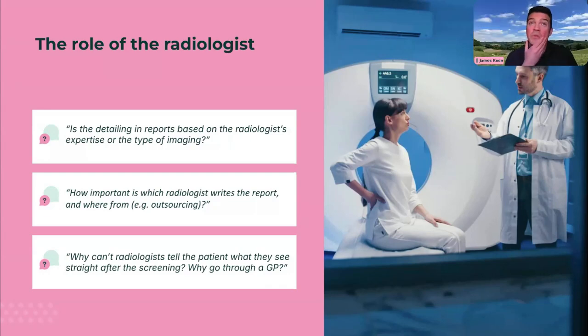The only caveat I suppose I'd put onto the end of that is that radiographers and radiologists, of course, do absolutely know what we're looking at on those images, and we will tailor our imaging approach reactively to what we're seeing. So if we've seen something that looks possibly malignant, we will alter our technique and make sure that that's covered and shown. So we may not tell the patient anything, but we'll be making sure that the pathway is swinging into action behind the scenes.